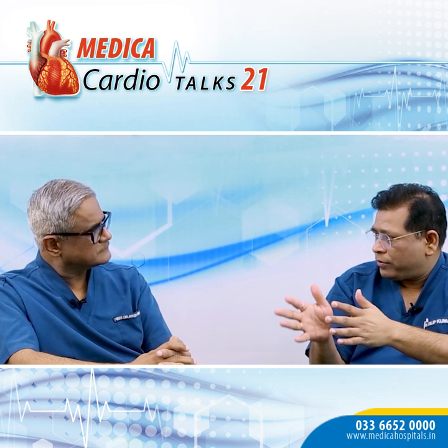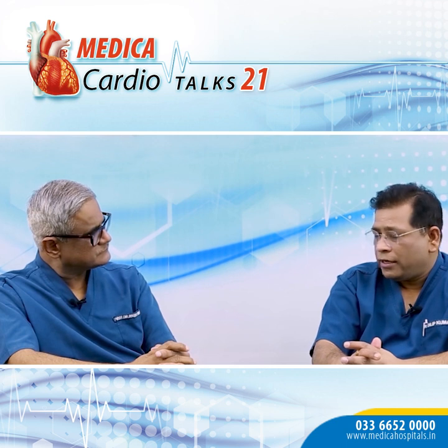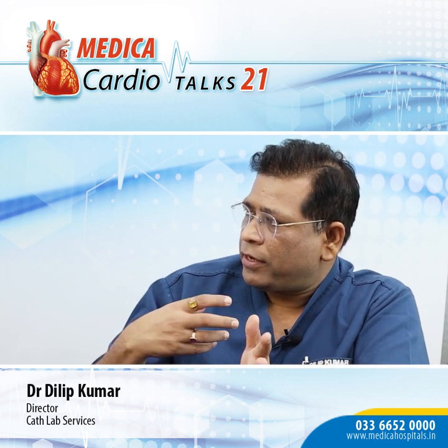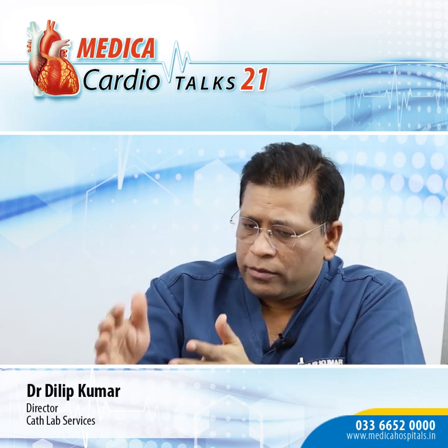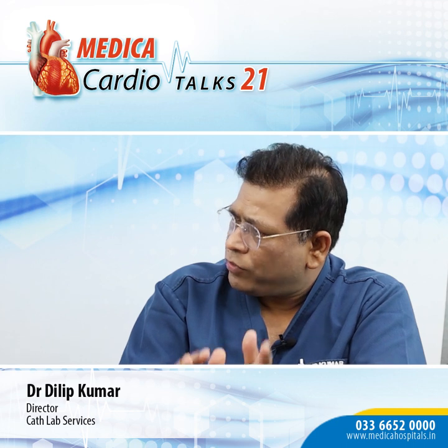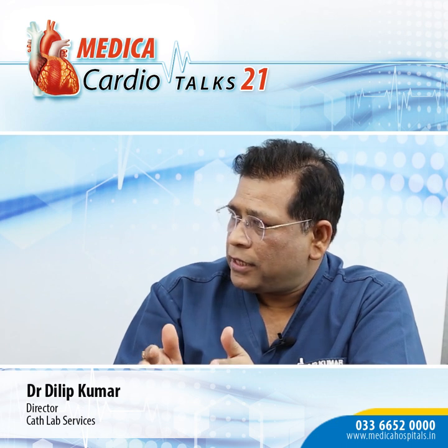They were being used in the tricuspid valve as well. But now dedicated TriClip devices have come, and in the TRILUMINATE trial, 30-day mortality was 0. That gave a very good insight that this device is really going to work, and it's a very safe device. You go through the venous system, place it and monitor it well. With increasing experience and refinements in hardware and tools, from mitral clip to TriClip, the complication rate has drastically come down. It's a very safe device, and results are much better. All other options are considered when these clips are not suitable.